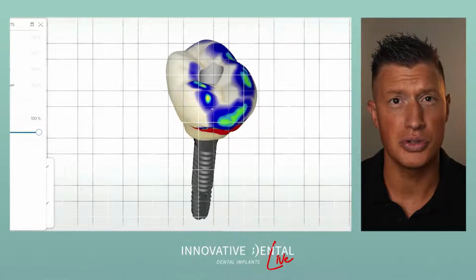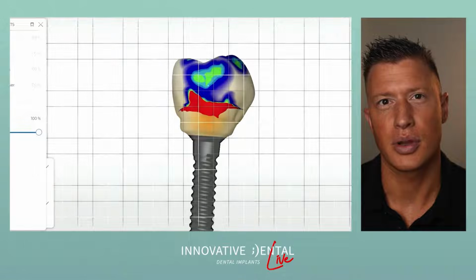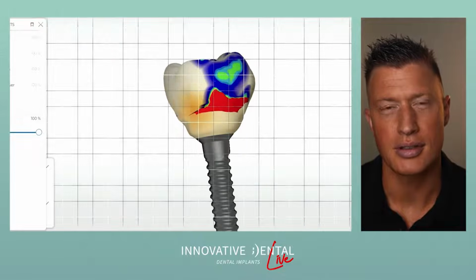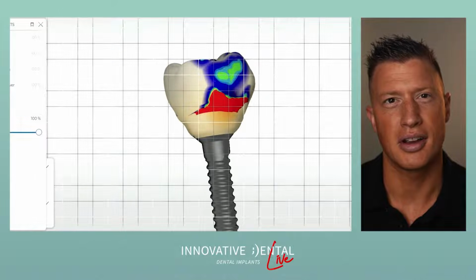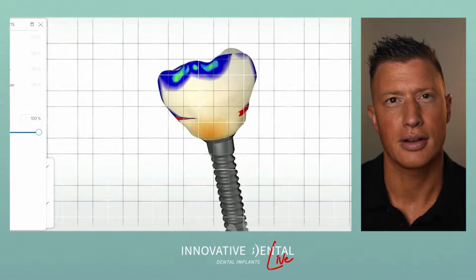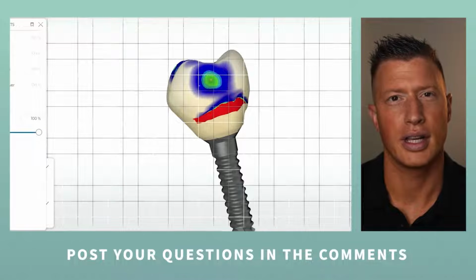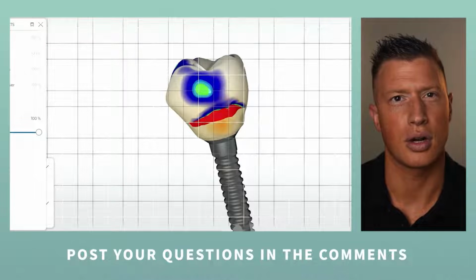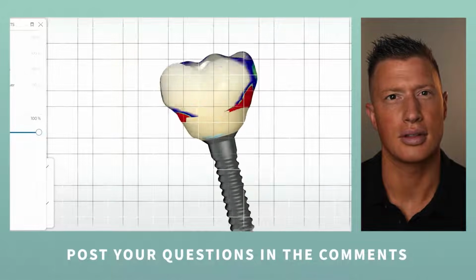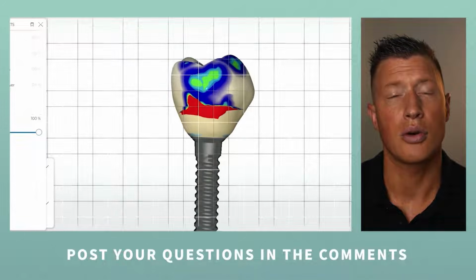We want her to be able to use this tooth. We just don't want it to be banging really hard. So we go ahead and adjust that, smooth everything up because we love smooth materials in the mouth. We don't want anything to be rough. And so you'll notice I'm doing that here, shaping it all nice and smooth. Then I'm going to address this contact a little bit, get it to where we have a nice, clean green in the software on our system, which is really the nicest connection there. Finish the smooth, and then now we're ready to mill.